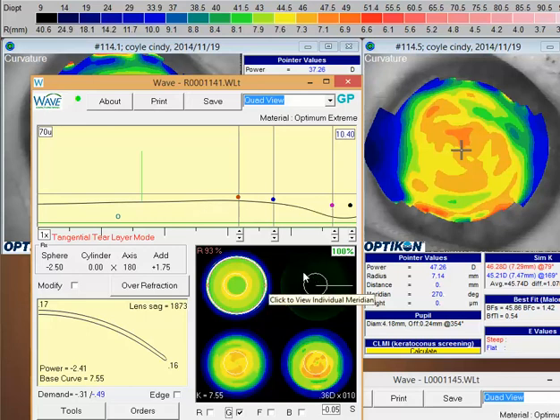The other thing I've noticed through the years is that when patients have lenses that seem to film up and get dirty, almost inevitably it's a patient who has borderline tear function, borderline dry eye, with a lens that's fitting too tight. So if you can loosen up that lens, you increase tear exchange. I think you'll find the lens doesn't get as filmy and uncomfortable for the patient. I think in your case it was after about 15 or 20 minutes.